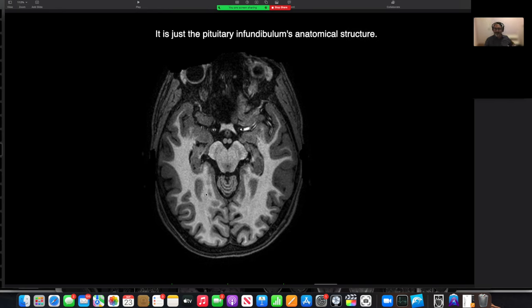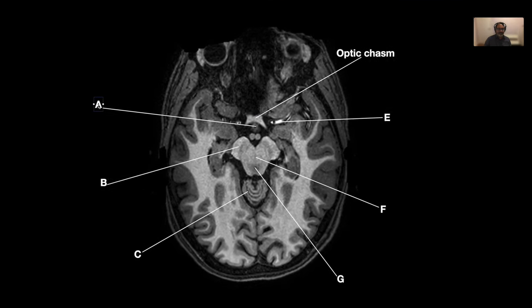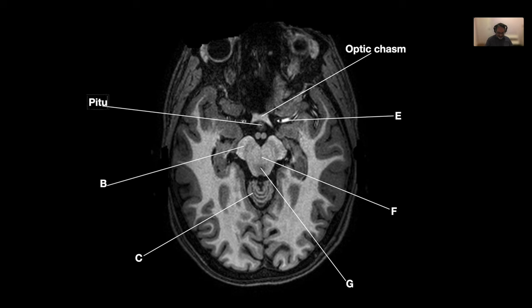Maybe in your neuroradiology rotation, you can ask why the pituitary stalk has that little hole in it. But okay, so that's your pituitary stalk. All right, so what's next?